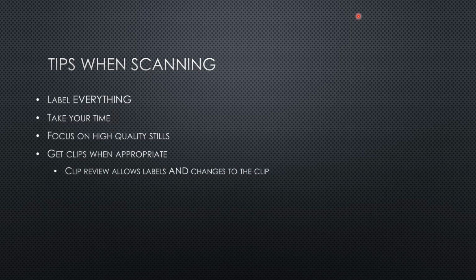When it's appropriate, get clips. My general rule is if a structure is moving, you should probably have a moving picture of it, right? So that's generally your heart and lungs almost exclusively. It can also apply, for example, in the eyeballs.